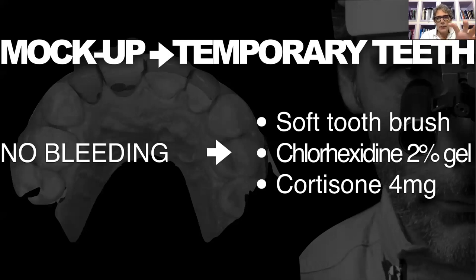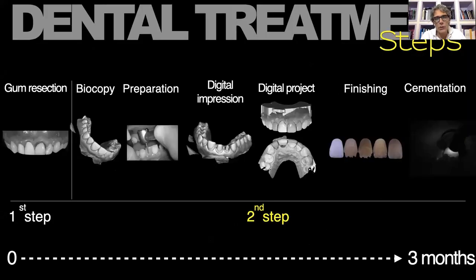That is fundamental, and everybody should know that we have to cement using the rubber dam. It helps me to isolate the operative site during cementation in order to obtain a more stable system after cementation between the natural teeth and the ceramic restoration.